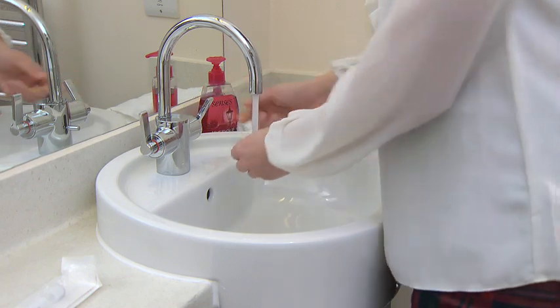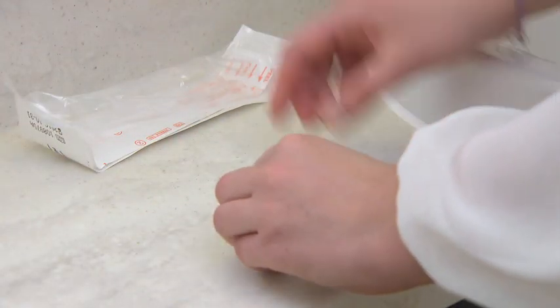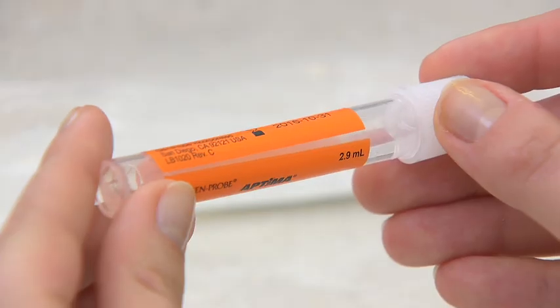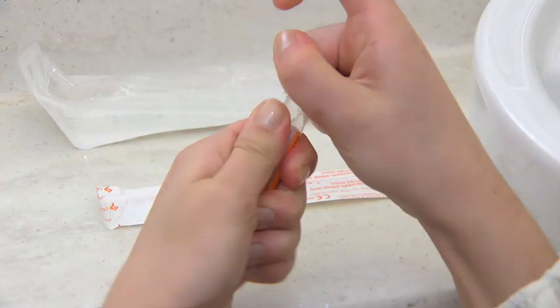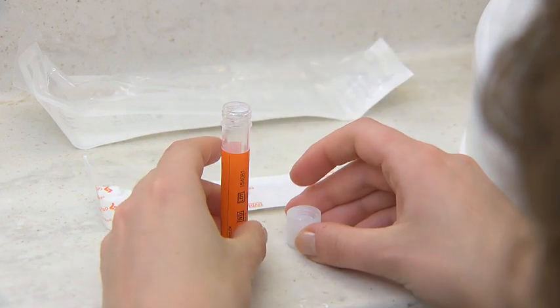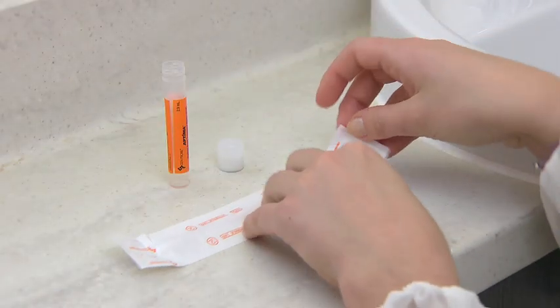First, wash and dry your hands. Take the lid off the sample tube and place the lid and the tube on a flat surface near to where you want to take the sample. Be careful not to spill the clear liquid which is already in the sample tube.